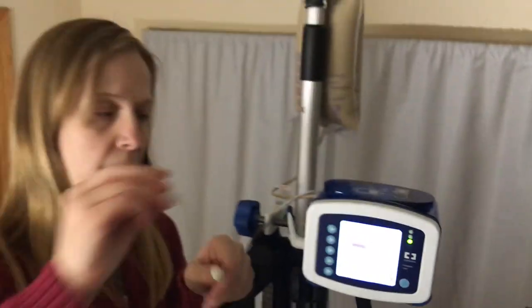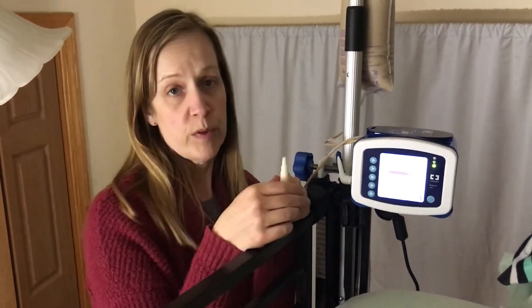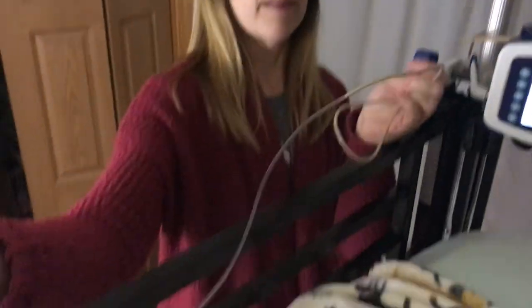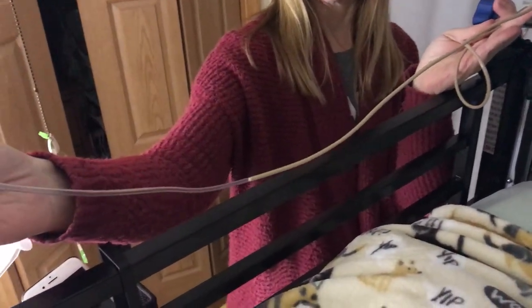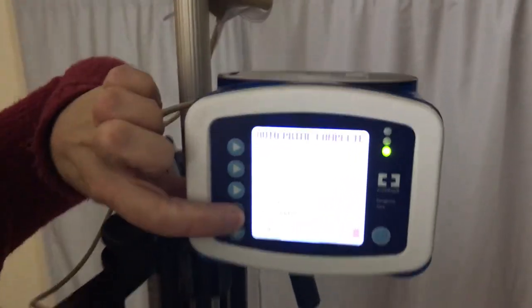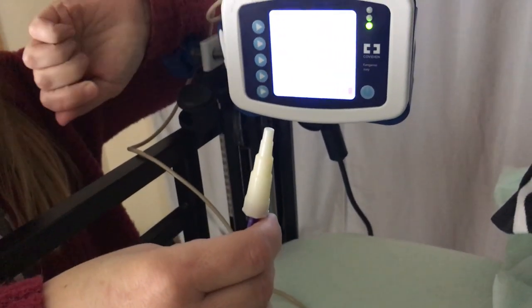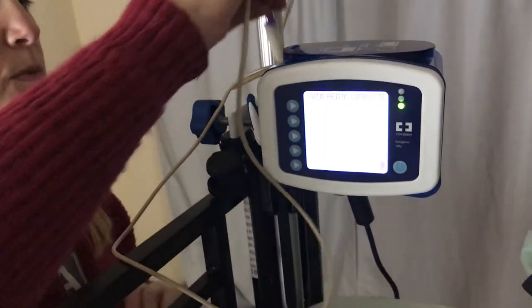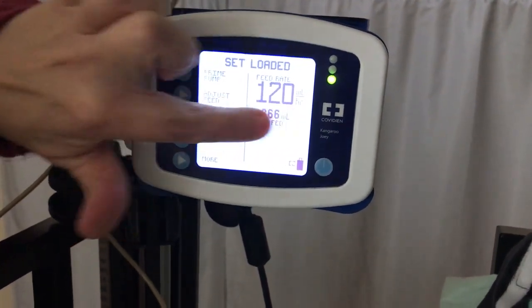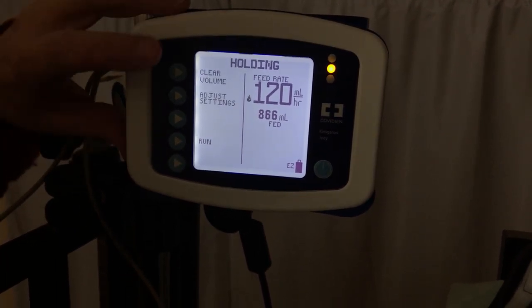One thing you want to learn is to remove the cap before priming. We've had some fun where the cap will pop off if you don't remove it — so be warned. You can see the liquid moving through the tube. It doesn't always move all the way to the end, so sometimes we have to manually do the rest. We try not to have air in the tube because that air pumps directly into the stomach. Now I'll press done, then run and hold, then clear volume.